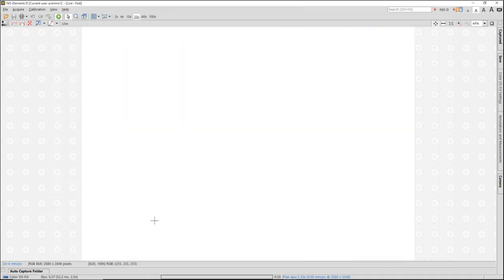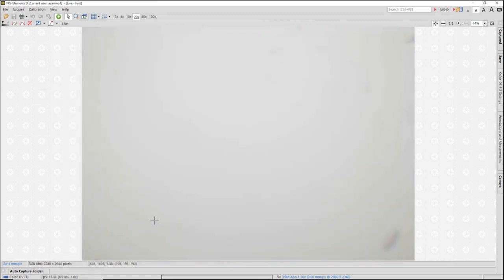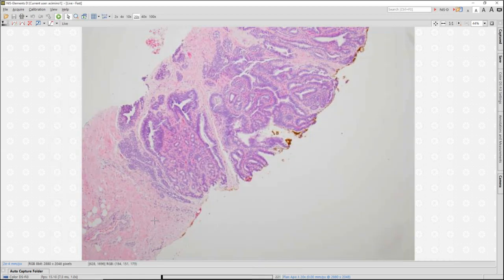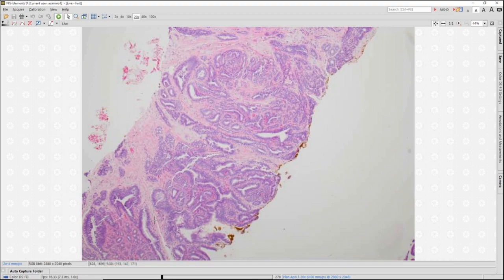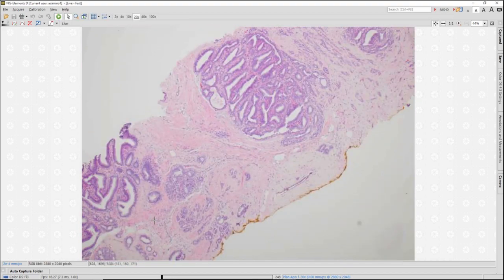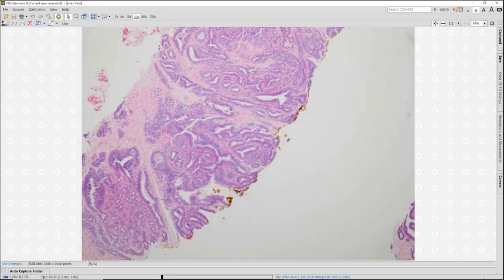All right, so here we're seeing atypical proliferation involving the underlying papilloma. That hyperplasia can be ductal, as I just showed you, or it can be lobular. Here's a core needle biopsy of a proliferation. We say, what are we dealing with here? Oh, okay, I see areas that look like hyalinized sclerotic fibrovascular cores. I see these fibrovascular cores of the papillae projecting into these spaces.